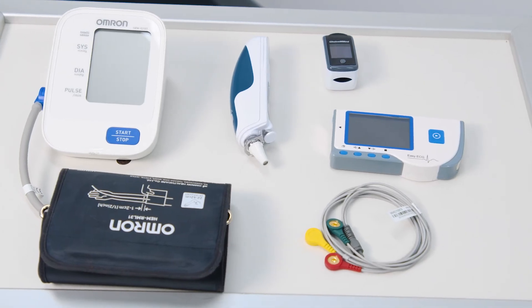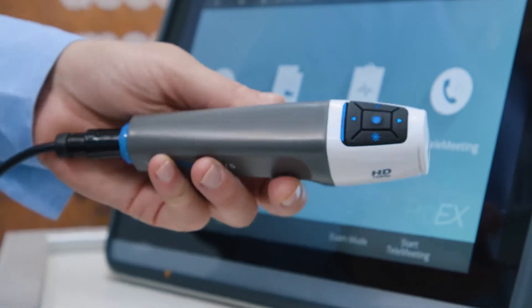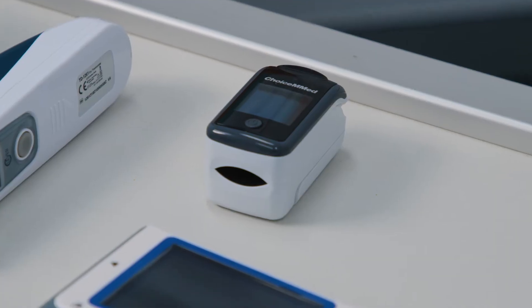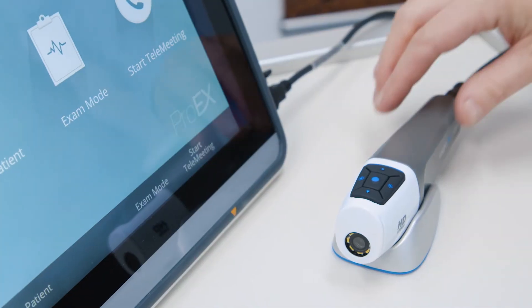This versatile unit supports a comprehensive range of interchangeable peripheral devices, ranging from general exam cameras, dermatology, dental and endoscope cameras, through to pulse oximetry, blood pressure, ECG, digital stethoscope and ultrasound probes.